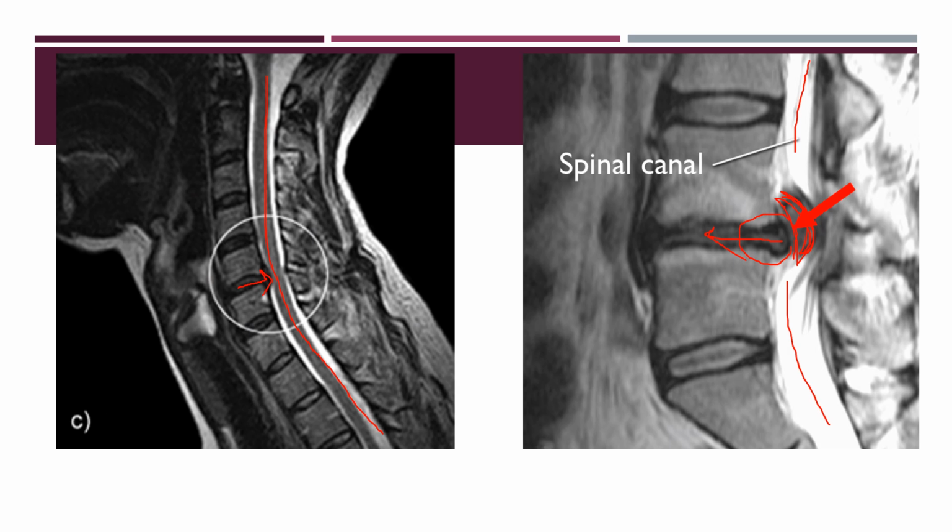It is also very important to know that mechanical traction isn't going to be a long-term fix for your patients. It may help reduce their pain in the short term, but for something like a really large herniation, you want to limit the expectations on what mechanical traction can do for your patients. So let them know that this might help in the short term, but we need to figure out ways to make you functional, decrease your pain over time, and letting them know that mechanical traction isn't always going to be the best option for them. We want to make them independent. We don't want to make them dependent on something like a passive modality.